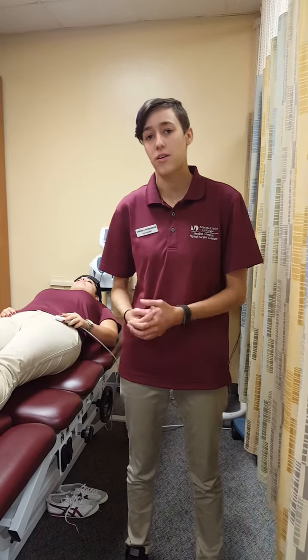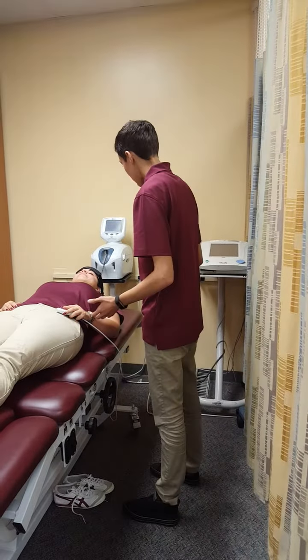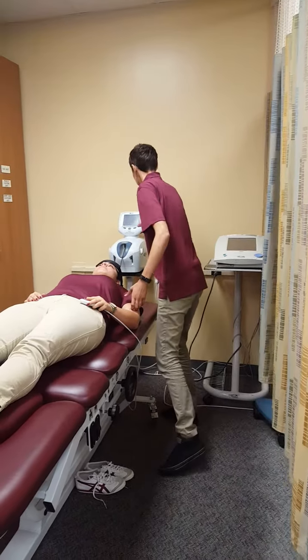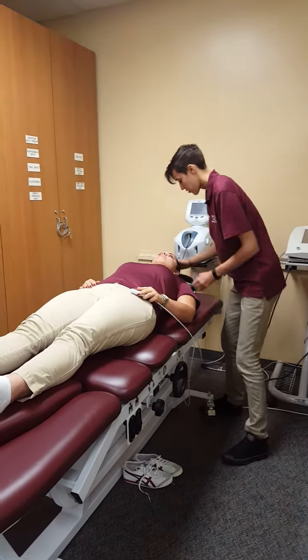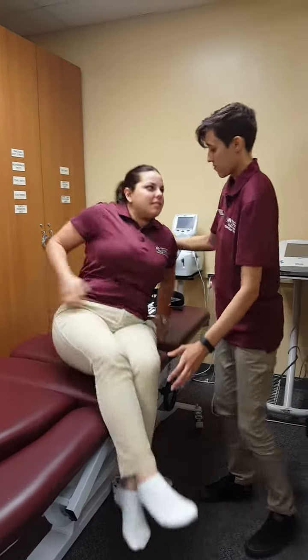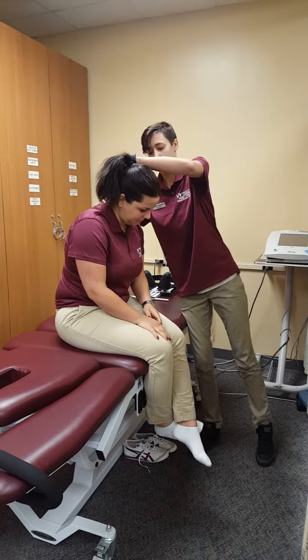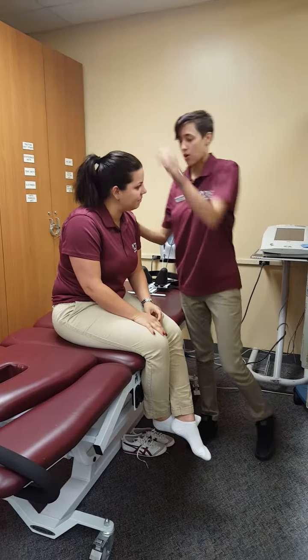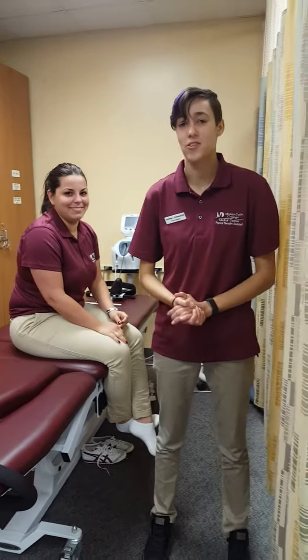So after the treatment time ends, which is 20 minutes, I'll come back and take her off the machine. Hello UC, your treatment is all done. I'll make sure the machine is off and take these straps off. How do you feel? Good. If you could just get up slowly. I'm going to reassess your skin. Your treatment is all done — have a great day. And that is how you apply cervical traction.